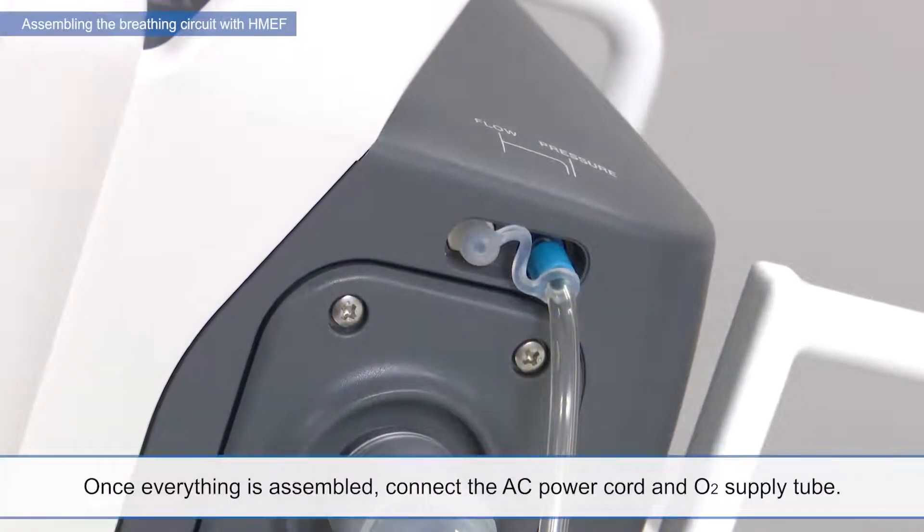Once everything is assembled, connect the AC power cord and O2 supply tube.